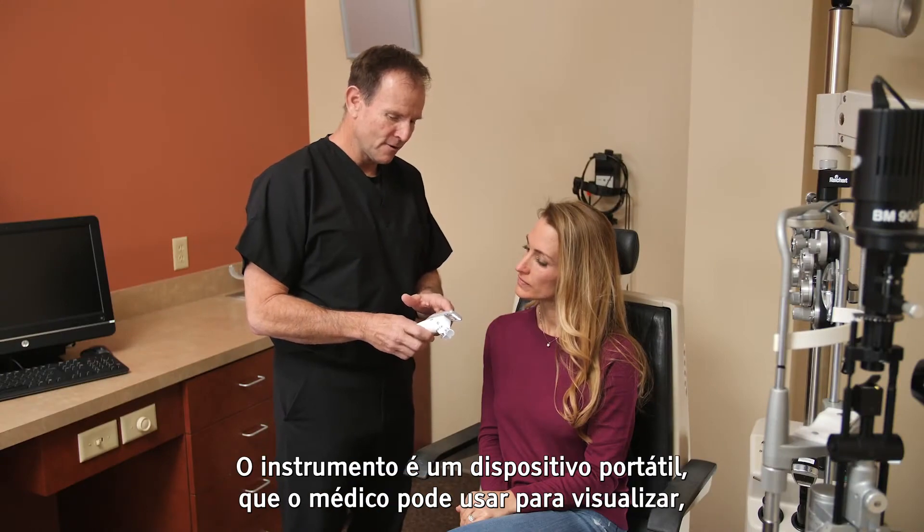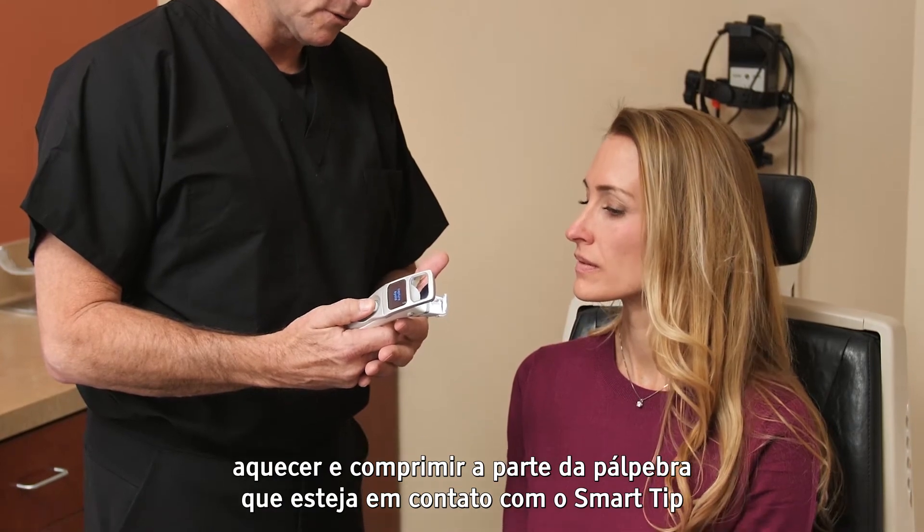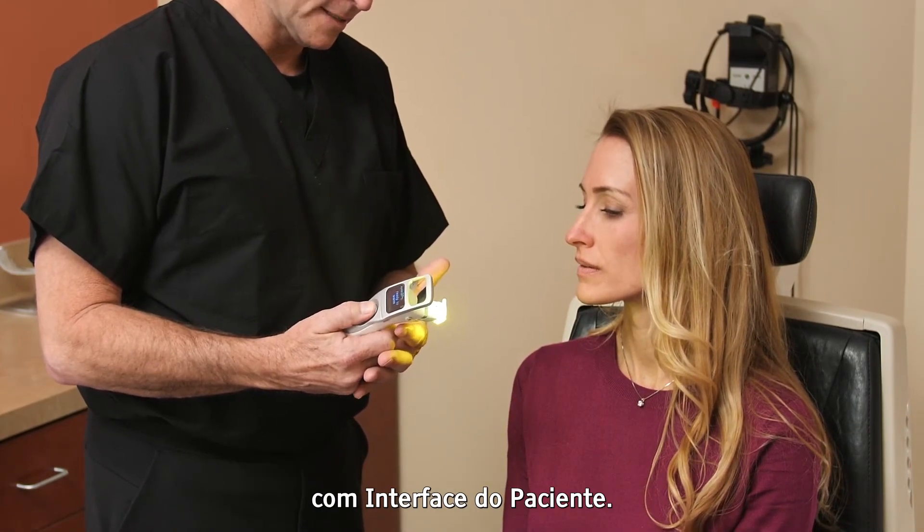The instrument is a handheld device that the clinician uses to view, heat, and compress the portion of the eyelid that is in contact with the smart tip patient interface.